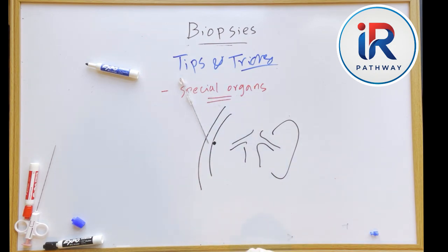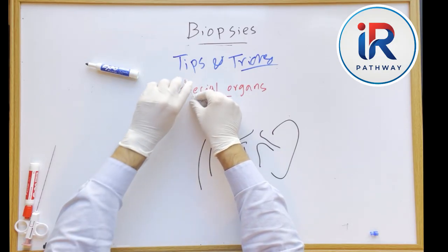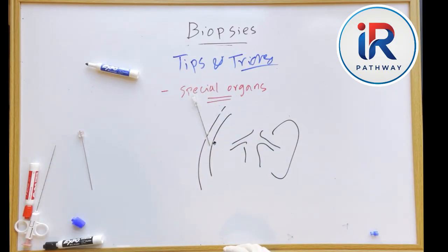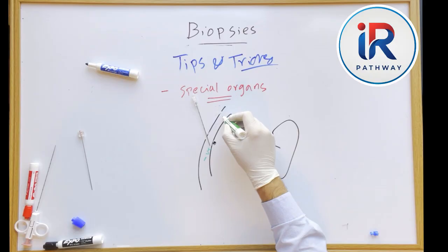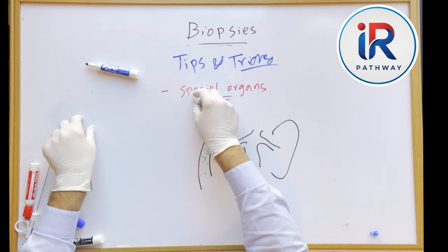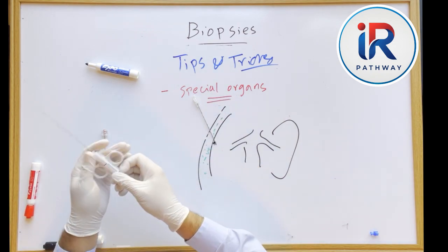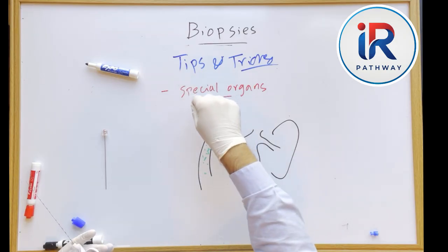The problem is that if this happens and you remove the inner stylet, without realizing it, you place the patient at a high risk of developing pneumothorax. As soon as the patient takes a breath, negative pressure is generated in the pleural space, air enters the pleural space, and pneumothorax signs occur. This often occurs right after sampling, when you are assessing the adequacy of your specimen. So you are inspecting the sample, leaving the needle open. This creates a very high risk of pneumothorax.